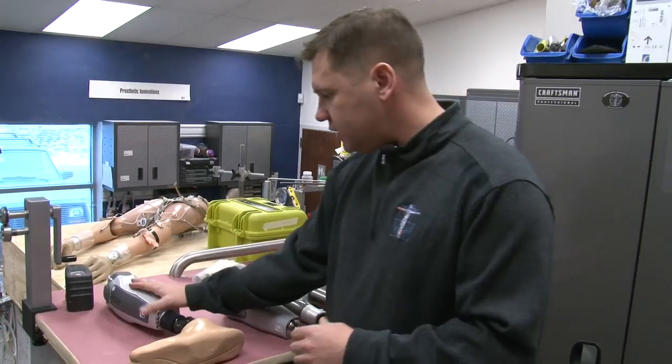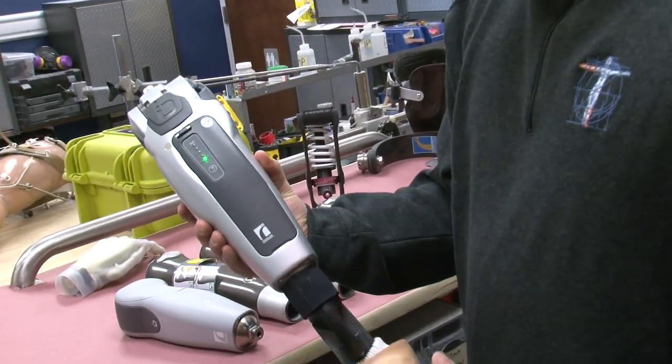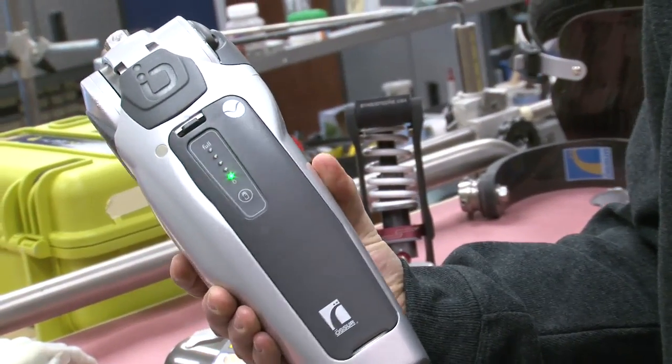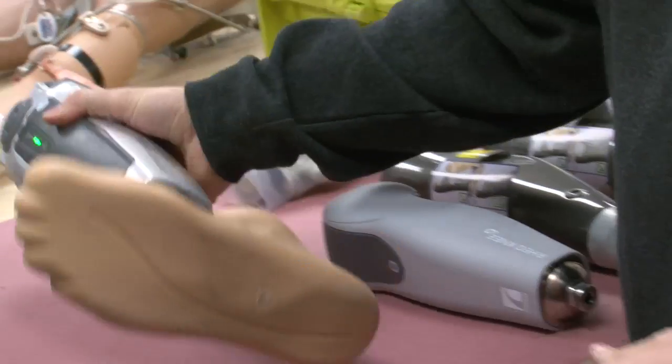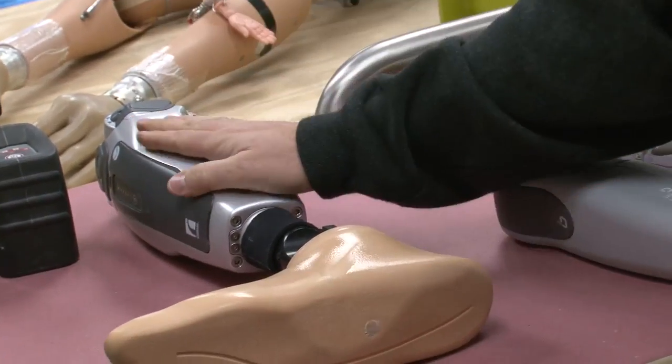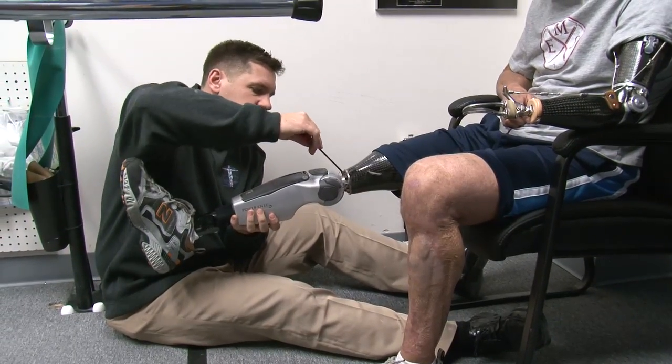This is an example of a Power Knee 2. There are only about 10 of them fit in the country, and we're lucky enough to have two of them here at Prosthetic Innovations. It's pretty exciting to be on the forefront of that technological boom really in prosthetics.